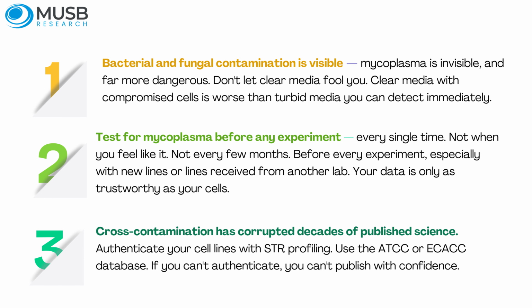3. Cross-contamination has corrupted decades of published science. Authenticate your cell lines with STR profiling. Use the ATCC or ECACC database. If you can't authenticate, you can't publish with confidence.